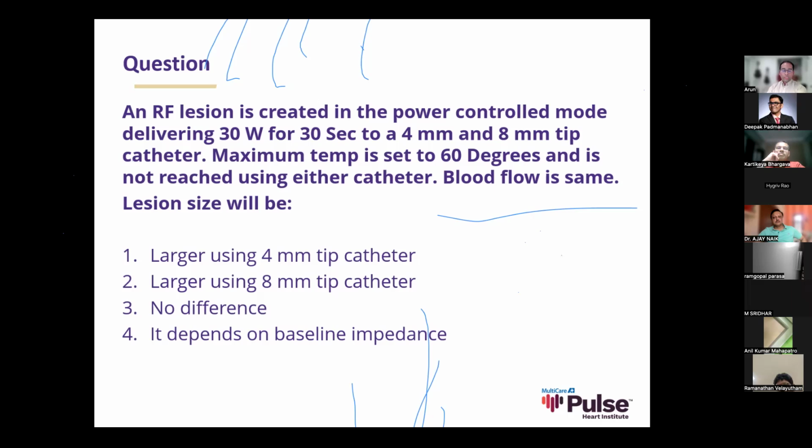So what is a very low impedance? You can have very low impedance scenarios too, like impedance less than 90. There are some patients who are very thin, and in thinner patients the impedance can be very low. In those people, I actually take off the second back patch. Sometimes we use a second back patch to reduce the impedance, and we take it off.